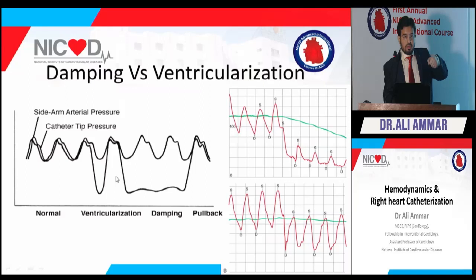When the operator decides that he has to adjust the catheter, he did a maneuver and the pressures damped. Our panelists shouted that the pressures are damping. So why are they damping? Because the catheter is hitting the wall of the coronary.